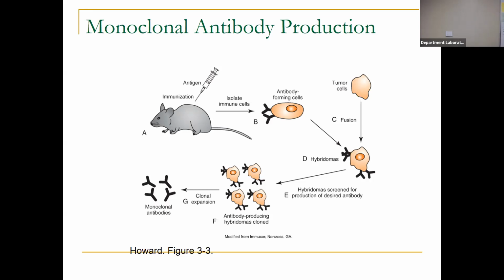This is how your manufacturers come up with your antisera and your AHG reagents. This is how it's all derived.